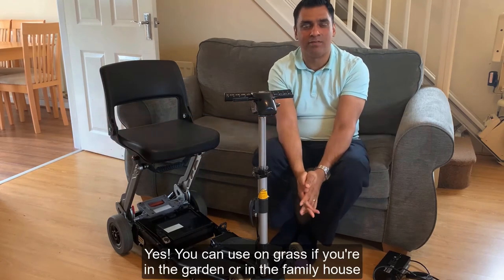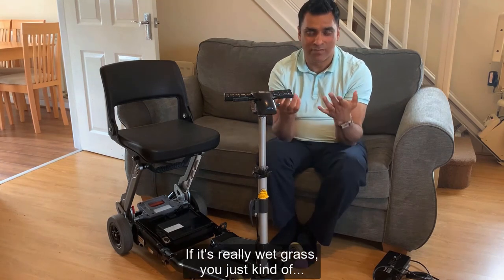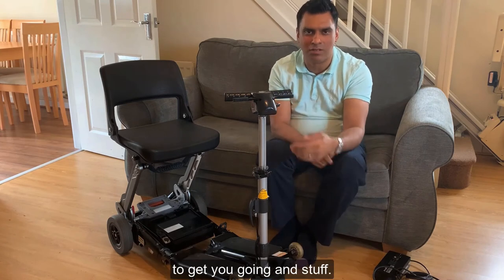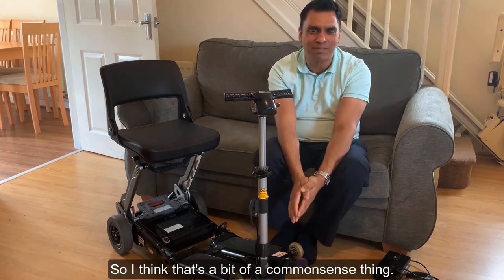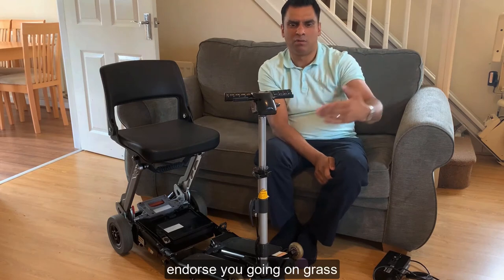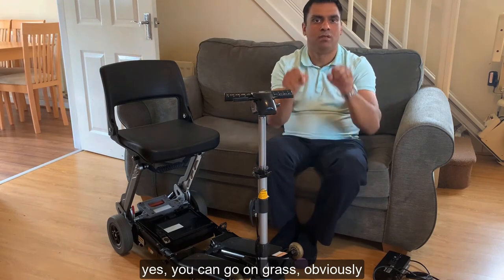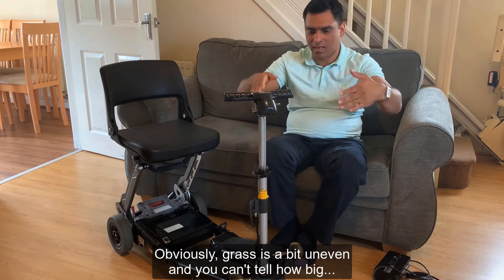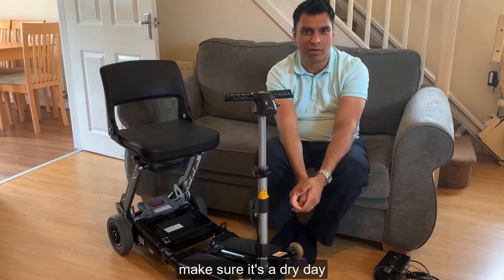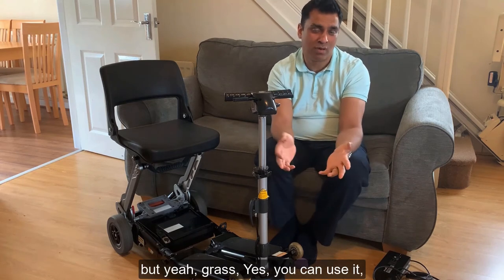Can you use the Luggy on grass? Yes, you can - for example in the garden with family. But not on wet grass, because you'll end up wheel-spinning and need someone to push you. I'm not sure if the manufacturers officially endorse going on grass, but sometimes you just need to. As always, keep two hands on the steering wheel since grass is uneven and you can't tell where divots are. I've got away with slightly wet grass, but it's not a risk worth taking.